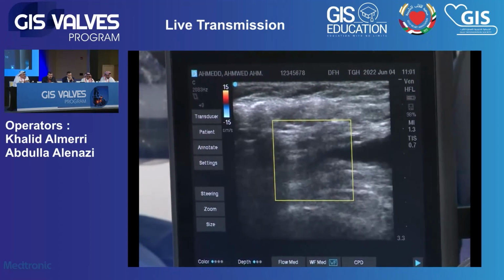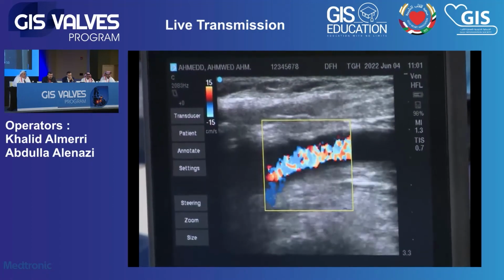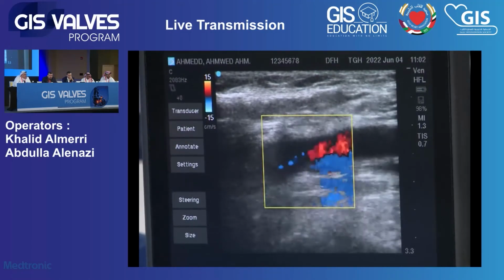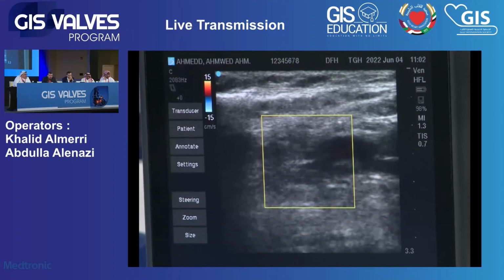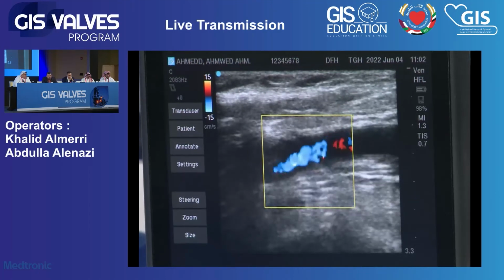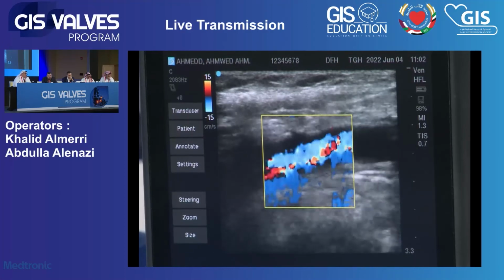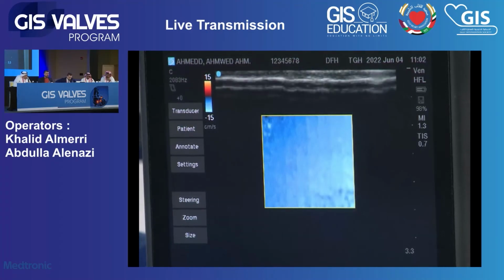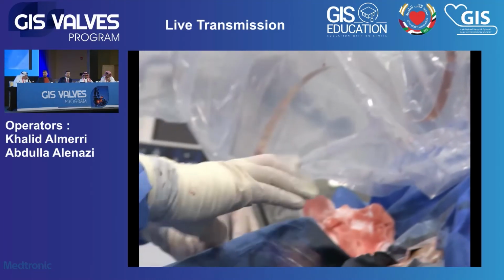To be honest, in our center, all the punctures done for TAVI are done with ultrasound guidance, including femoral, arterial, and venous. By and large, all the femoral arterial access for non-TAVI is also done with ultrasound. To be honest, our experience with ultrasound has been really good. Since we adopted this technology, the risk of complications went down a lot. I think that is the trend now, and we believe it adds a lot of benefit for the patient and reduces peripheral complications.